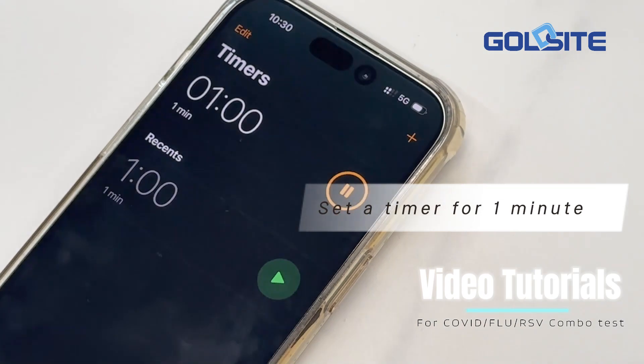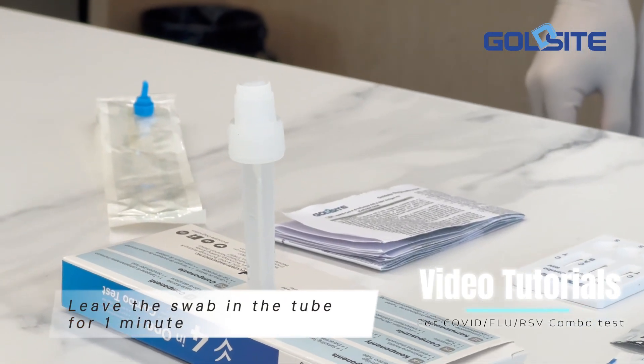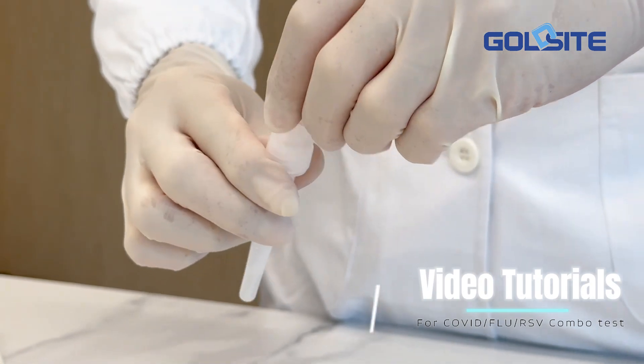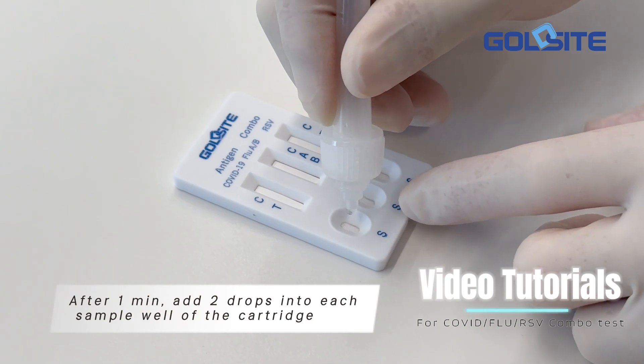Set a timer for one minute and leave the swab in the tube for one minute. After one minute, add two drops into each sample well of the cartridge.